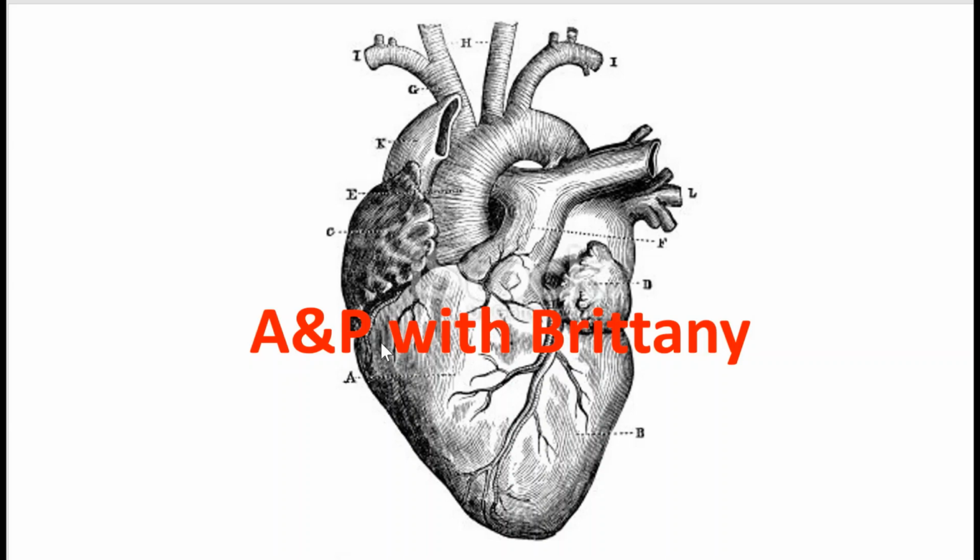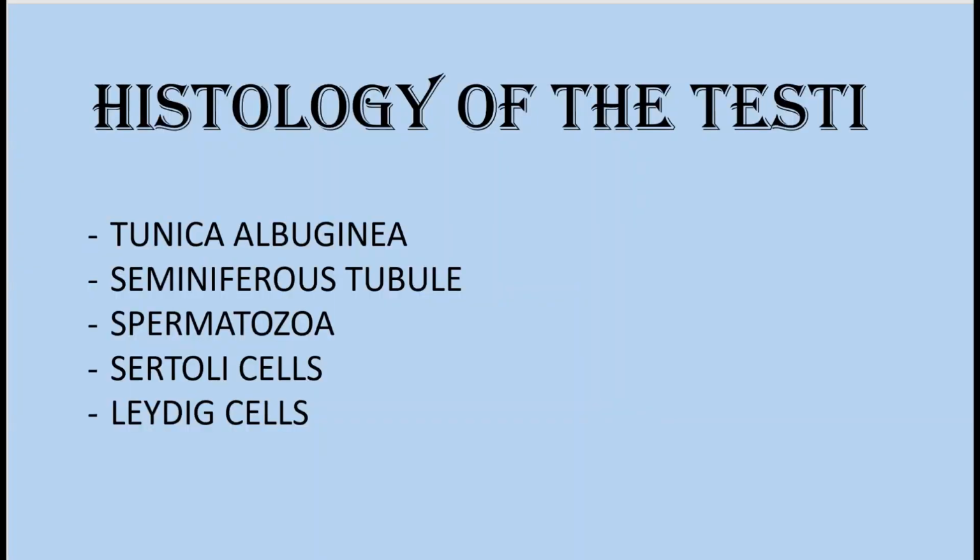So we're going to be going over the reproductive system histology for men and women. We're going to cover the testis, the ovary, and all of its goodness, and the uterus. So hang tight. Here we go. First, we're going to start with the one that I think is the easiest, which is the histology of the testis. I went ahead and put our list here of all the things that we have to find, and we're just going to jump right in.